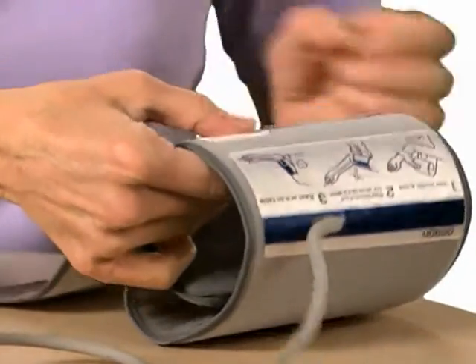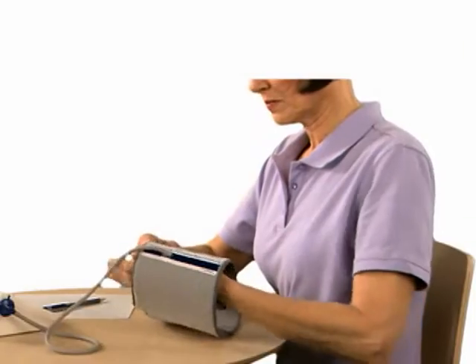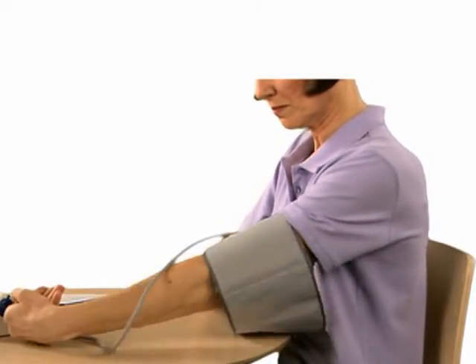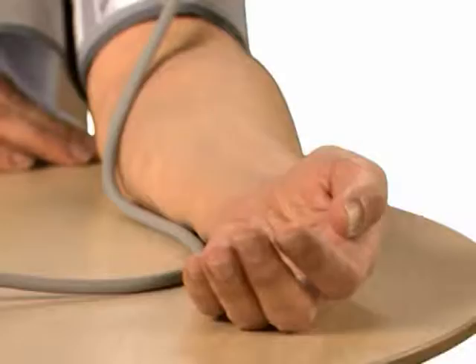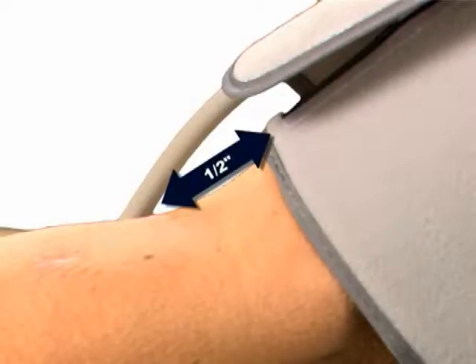Hold the grip on the cuff securely with your right hand, placing your thumb on the thumb grip. Place the cuff directly on the bare skin of your left upper arm. Make sure the air tube is on the inside of your arm. Align the bottom of the cuff approximately 1½ inch above your elbow.